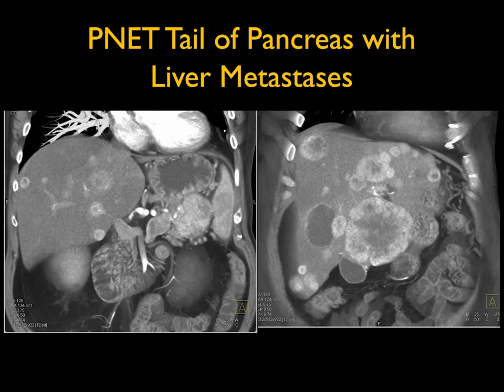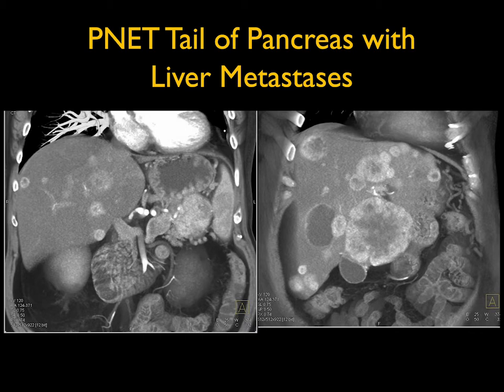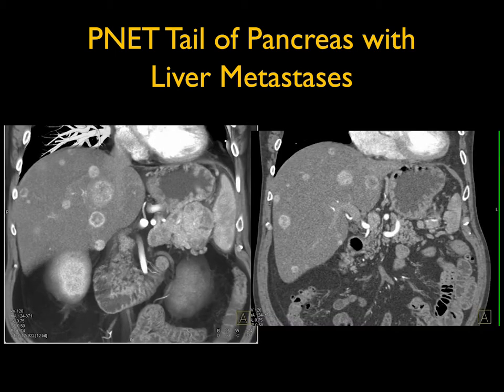In case number one, you see a vascular lesion in the tail of the pancreas. Pancreatic lesions that are vascular — you think about neuroendocrine tumors, and also metastatic renal cell carcinoma if the patient had a prior nephrectomy or partial nephrectomy, particularly for clear cell RCC. This is a very nice example showing the typical neuroendocrine tumor giving liver metastases, which are also very vascular, widespread, measuring from several millimeters to over five centimeters.